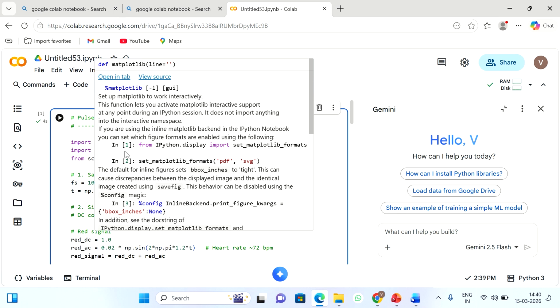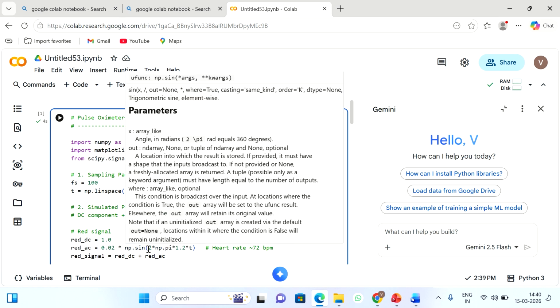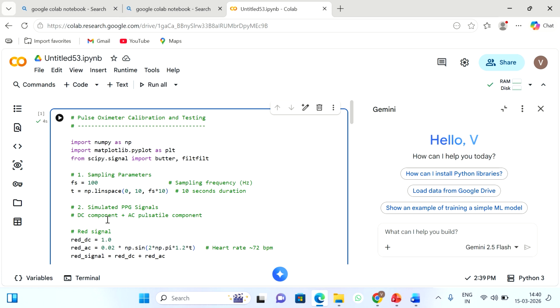Here, to simulate a pulse oximeter system, we have to process red and infrared PPG signals, and we have to estimate SpO2, that is the oxygen saturation level. This experiment simulates red and infrared PPG signals. Then it adds noise. Then it filters the signal. Then it calculates the AC and DC components. Then it computes the ratio of ratios and estimates SpO2 using a calibration equation. So we will get the expected output SpO2 value around 95 to 100. We are getting 90%, so no problem. And then we plot the two PPG waveforms, red and infrared.